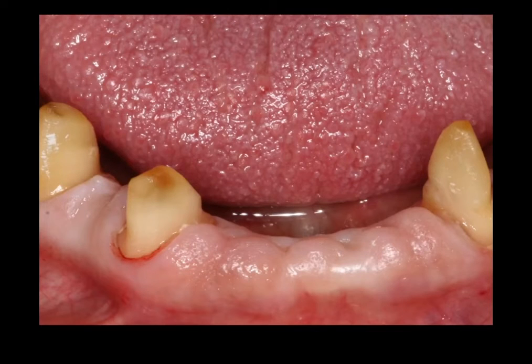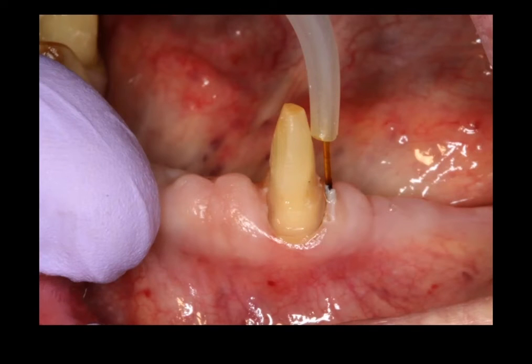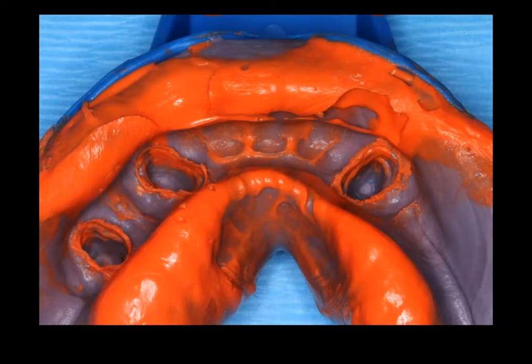Here's another area where we prepared some teeth, and we're going to use the diode laser, and here you can see I was able to control, with a little more experience, not allowing heat to generate and using the disposable tip around the tissue. We can examine our margins, take our hydrogen peroxide and wipe them. And you can clearly see, especially the tooth on the right-hand side, all those margins very, very clearly, very precisely. And we can take our final impression, which is very accurate.